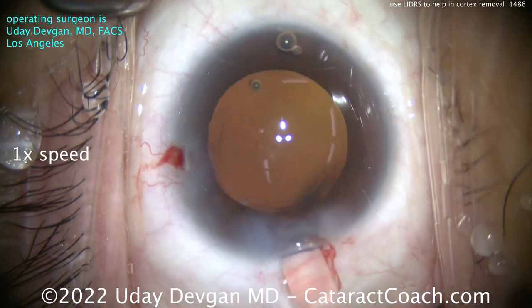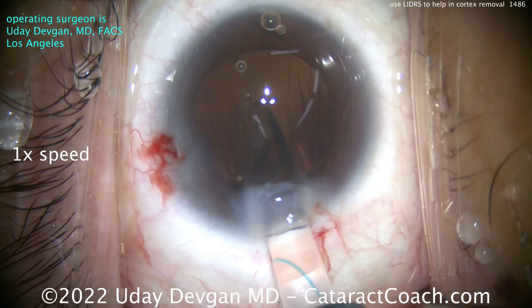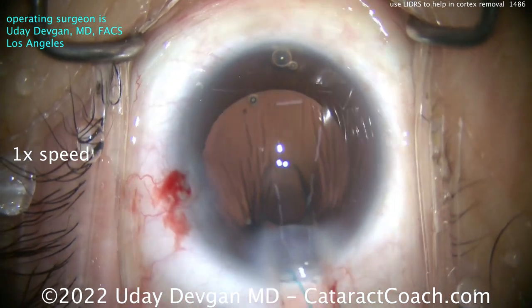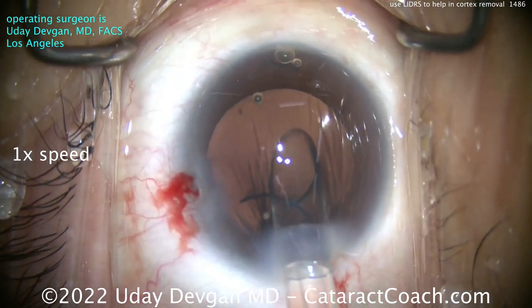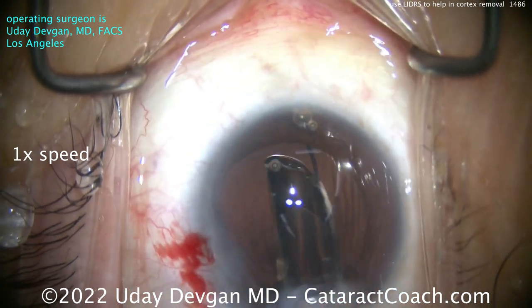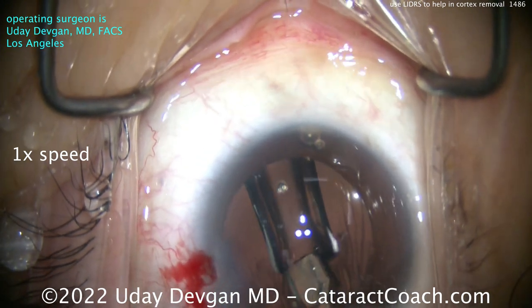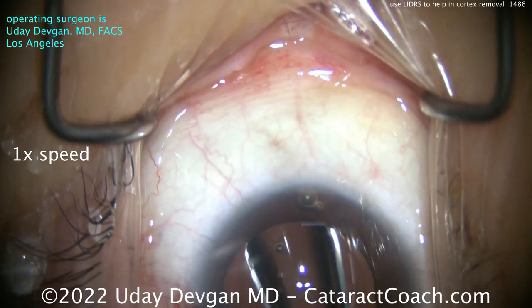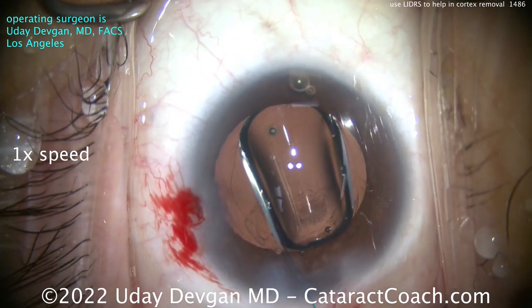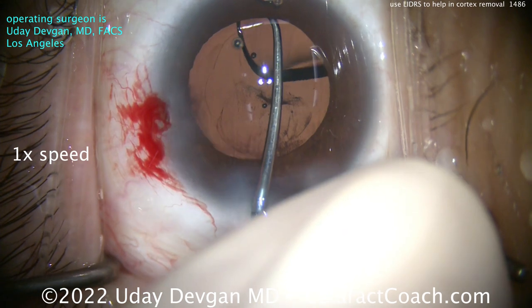This is a three-piece lens in a meniscus design for these ultra-low dioptric powers. Here comes our lens — we're back to normal speed for the rest of the video. You know our 7L rule: the first haptic comes out and should look like the number 7. That looks good — there's the 7. Then the trailing haptic, as it opens up, should look like a capital letter L. That's the 7L rule. There's the L.